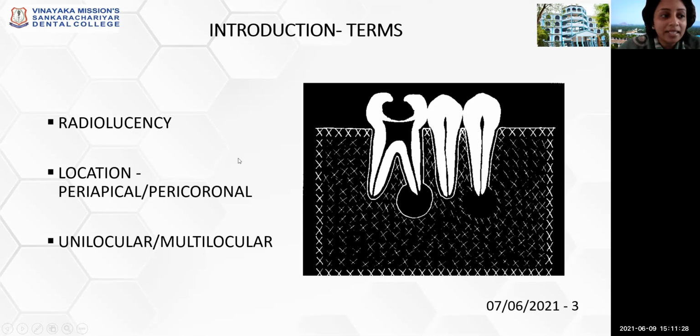The radiological examination is the most important investigatory method to evaluate any lesions of the jaws and teeth. These bony changes are due to the osteoclastic changes seen at the apex of the tooth, hence the name periapical radiolucencies. However, these pathologies are to be differentiated from tooth-associated or systemic diseases which cause this radiolucency, and are to be ruled out for efficient diagnosis.